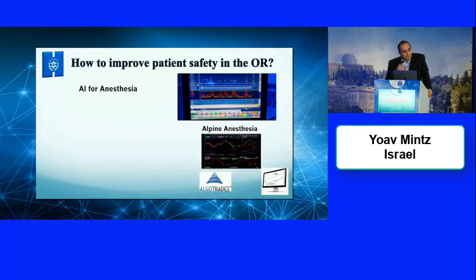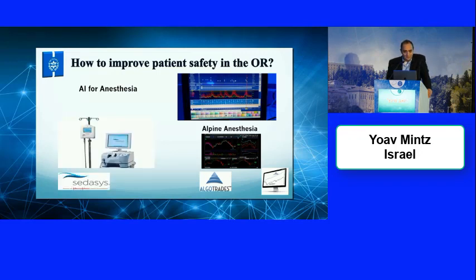But we also know that there are algorithms today that monitor the stock market, and they react fast to every subtle change, buying and selling stock. Why can't we have this kind of algorithm in our OR, controlling our blood pressure, heart rate, saturation, and so forth? So we do have it. This is a system called Sedasys by Johnson & Johnson, and this is exactly what it does. It does it perfectly. However, it was banned by the anesthesiologists themselves, probably because they're afraid for their jobs.